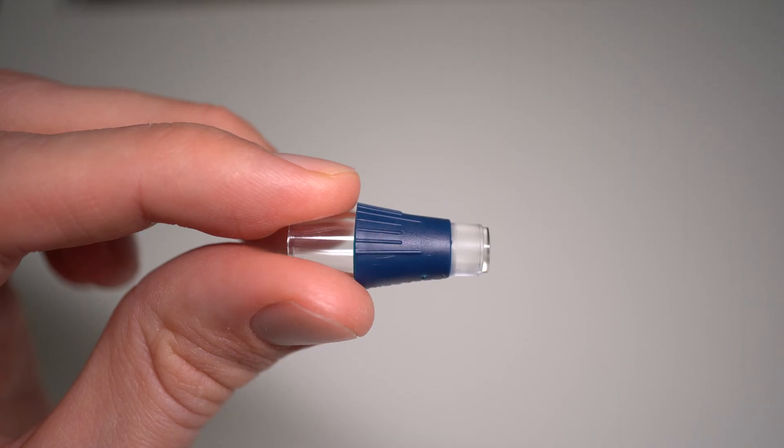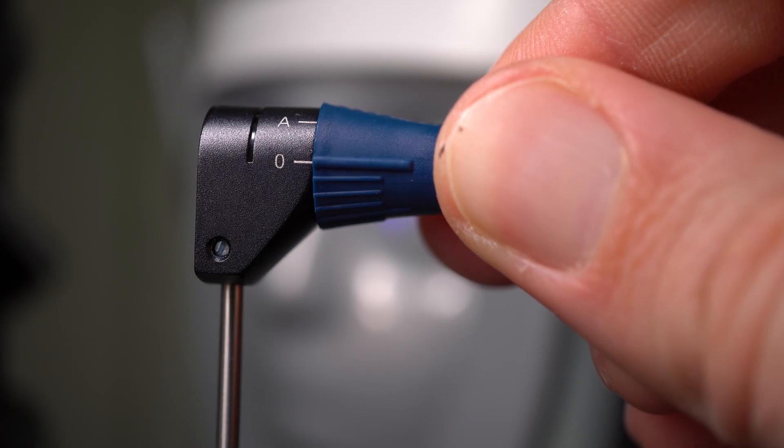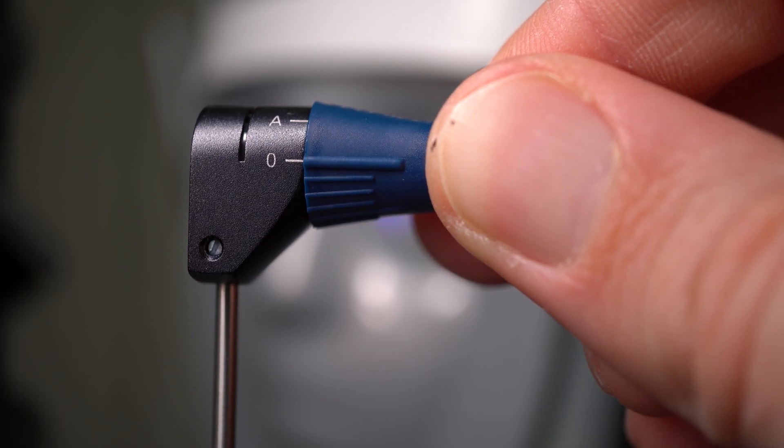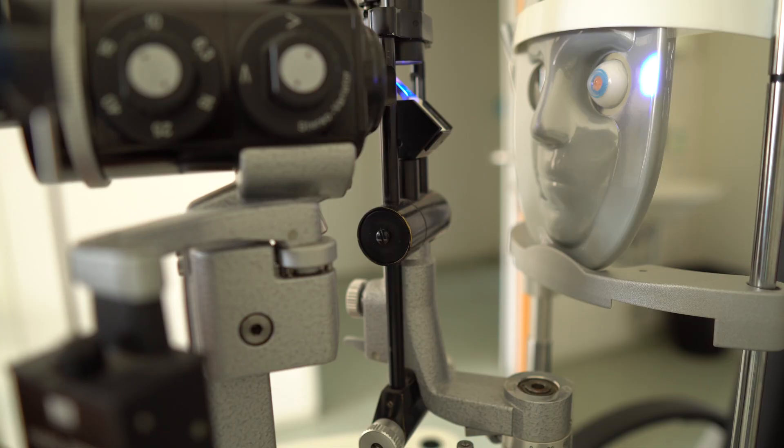Then you're going to take a clean measurement tip. We have single-use tips at our clinic, but if you have the original ones they can be re-sterilized after every patient. Make sure to slide it in correctly so the first engraved line lines up with the white line on the measurement device. The measurement device itself is usually mounted directly to the slit lamp.